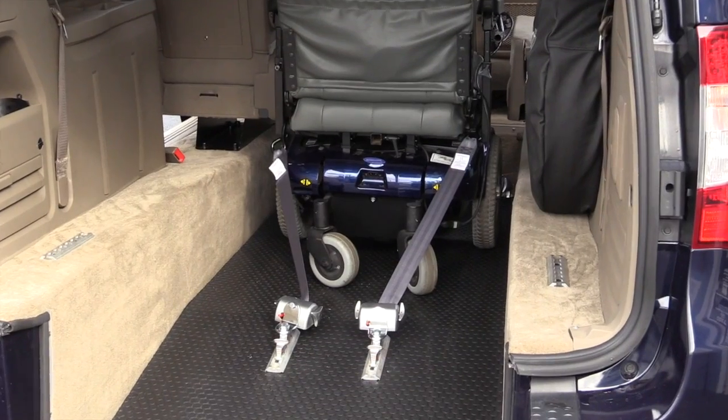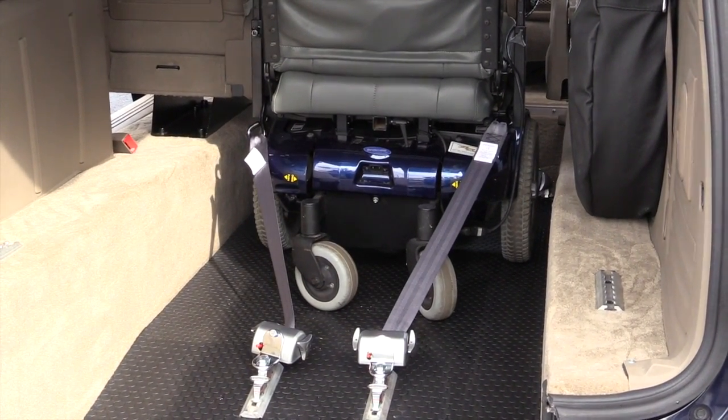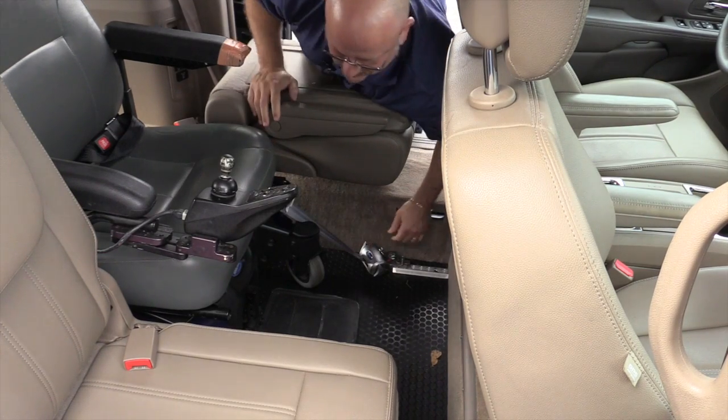Now your wheelchair is secured in the rear with two retractable tie-downs. So you can move to the front to secure the two in the front. The front retractors are easily connected to the wheelchair.